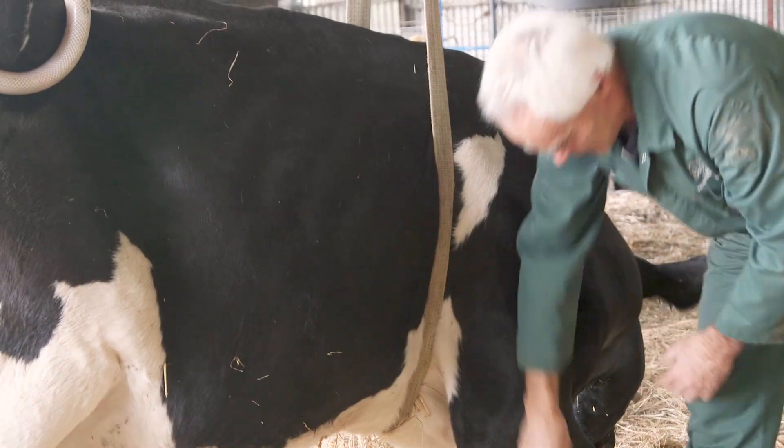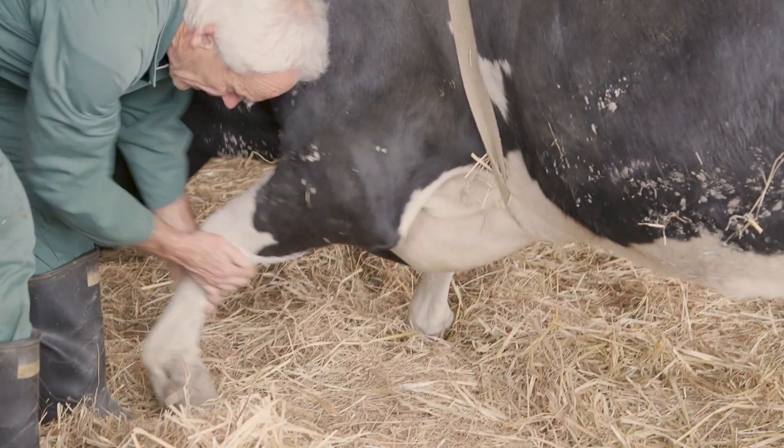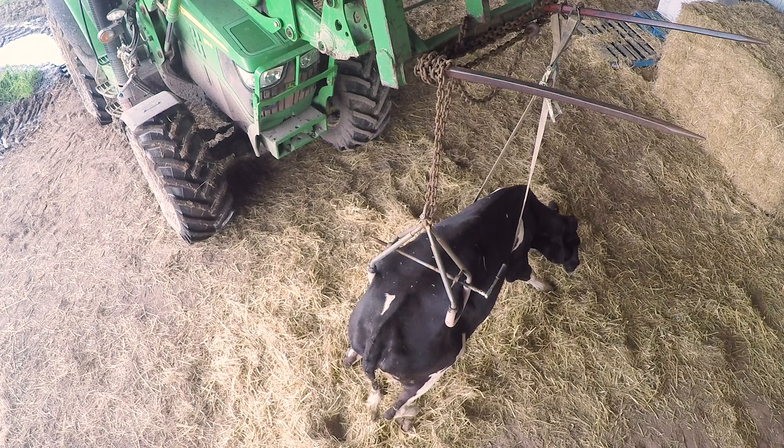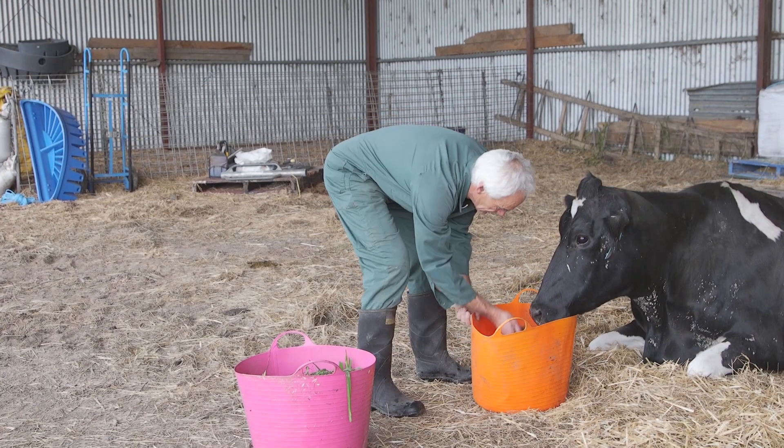In this case the cow is not standing effectively. This may be because she can't due to damage, or because she won't for behavioural reasons. In either case, lifting will do more harm than good. Lower her to the ground, continue to nurse her properly, and try again later.